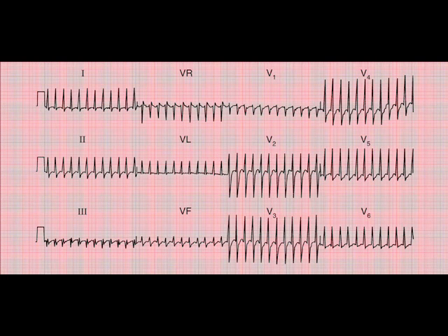What I would say is you need to assess the patient's hemodynamic status immediately by taking the blood pressure and other measurements, looking whether they're cold and clammy and so forth, because this needs to be treated promptly. This is an emergency. You can't have a patient with a heart rate this high and allow them not to be treated promptly. This will probably be by pharmacological method, could be by cardioversion, and then later on they'll need to be treated probably in a catheter lab.